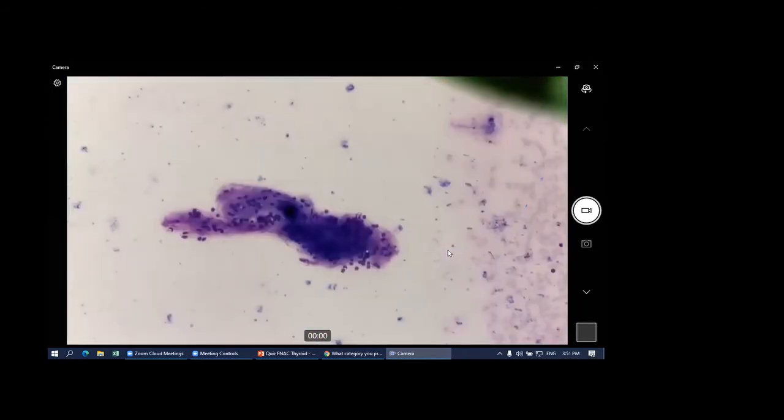So the cells are actually quite benign looking, even though they are dispersed, but this is not the majority. Okay. Okay, the majority of it is like this. Okay, you can see that, right? Yeah. Right. Okay, and this. You can see that, right? Yeah. Those are all microfollicles.